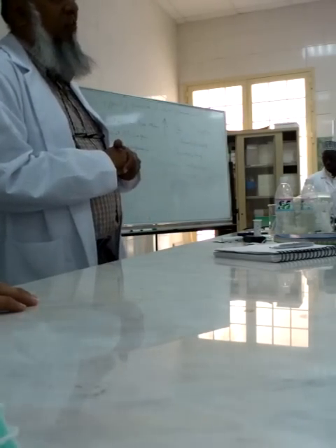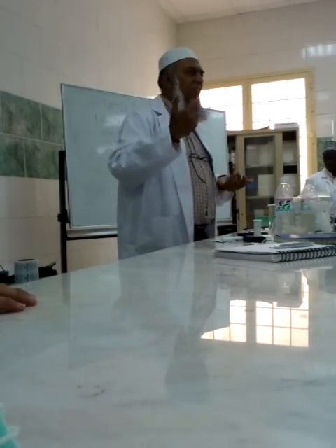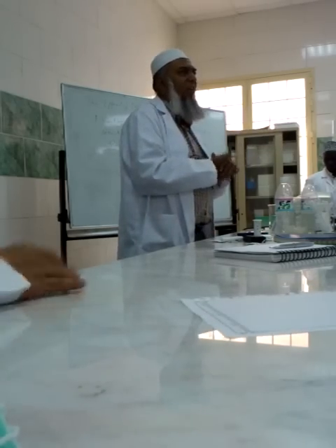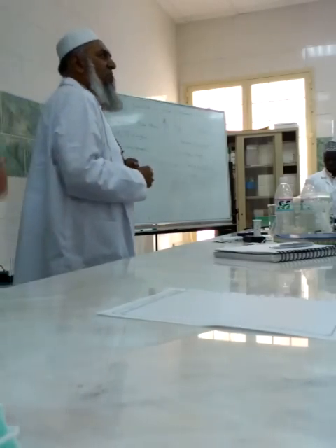Okay, not enough exercise, it should not decrease, but at least the value should remain the same. 522, 523, 525. Why 545? Why did it change? The reason is gluconeogenesis.